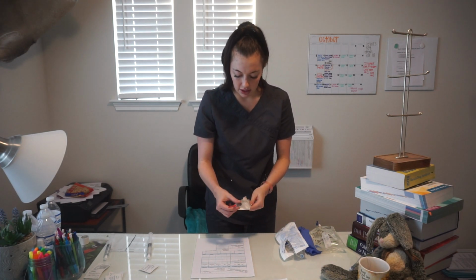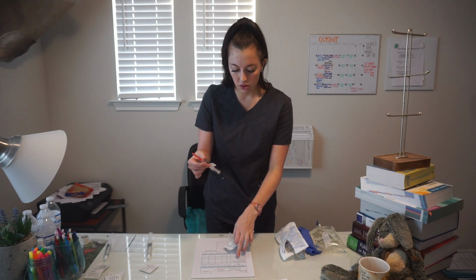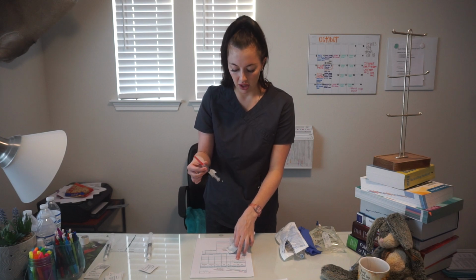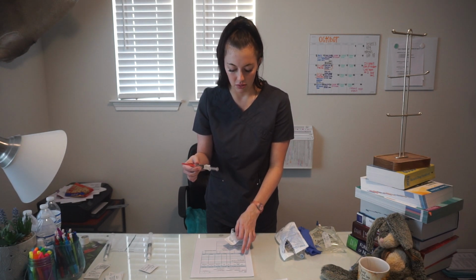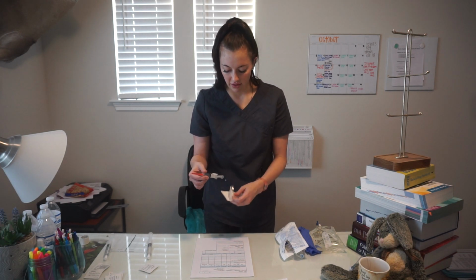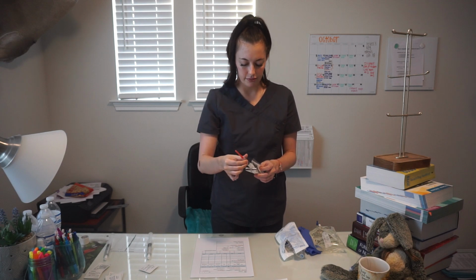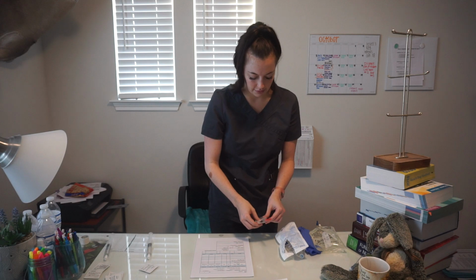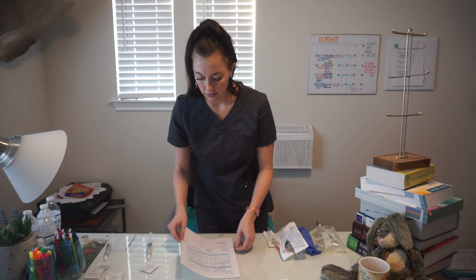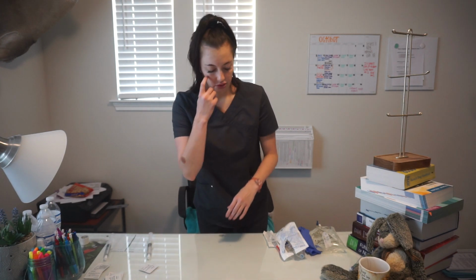Then I have labetalol, 20 milligrams IV push as needed for blood pressure greater than 170 over 90. So that's 4 mLs. Okay. I am ready to enter the patient's room.